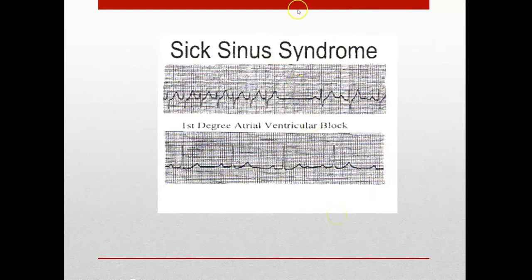Okay, so this is an example of sick sinus syndrome up here. Basically with sick sinus syndrome, you get really, really tachy, you pause, and then you go brady. You get really, really tachy, you pause, you go brady. So we're literally doing all the things, and it's just kind of overloading our heart. So we put in a pacemaker to help pace it and keep a normal, steady rhythm and not bouncing all over the place.